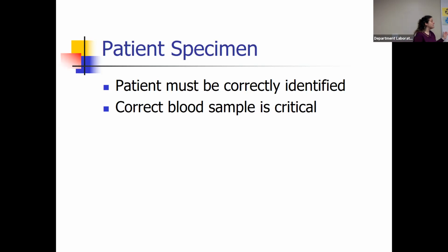Or if your female has had a marriage or divorce and has changed her name. So if she had an established history at your facility and then she got married and her name changed, you have to verify that name change, right? Patient identification is very important.